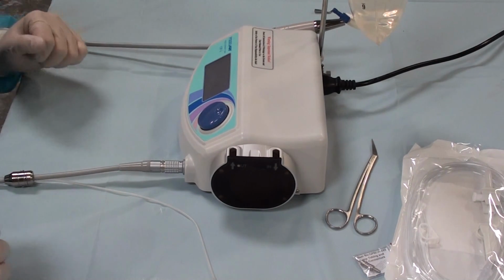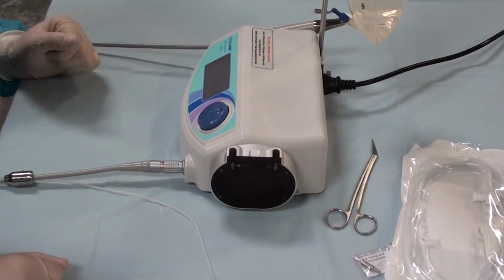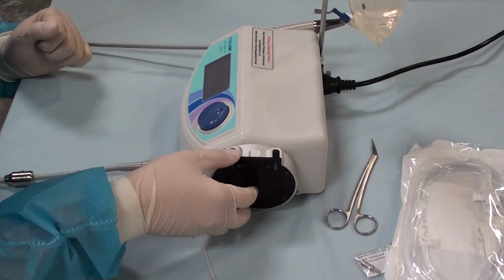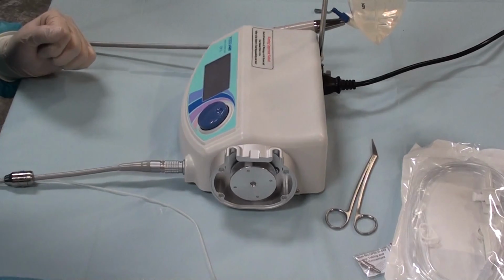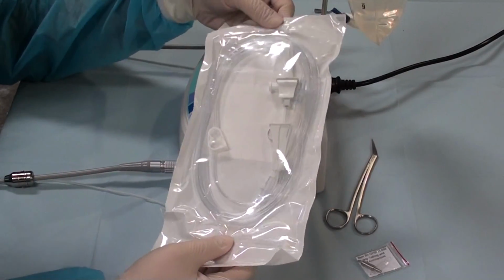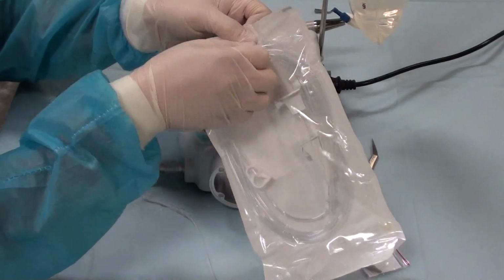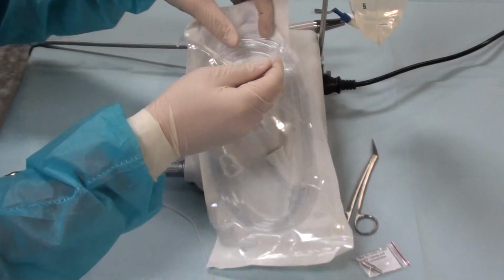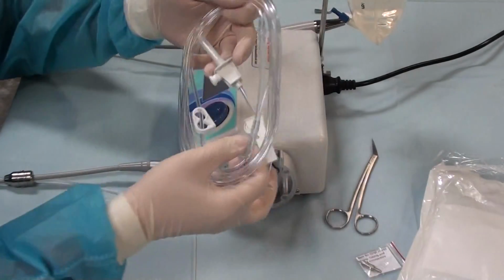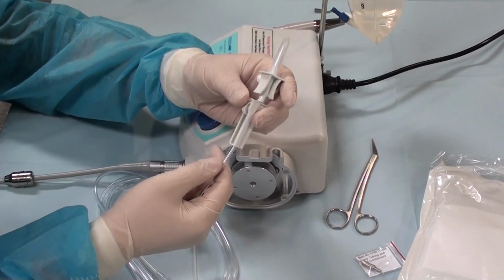So now we're gonna be installing the disposable tubing for the new pump housing unit. You start off by removing the magnetic cover and you set it aside, and you grab your sterilized pouch which contains your disposable tubing. So you want to open up the pouch and remove the contents, and immediately you'll see one end with the spike on it, and that's where you want to start.